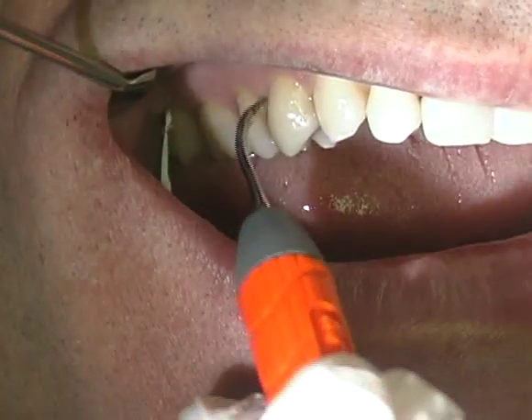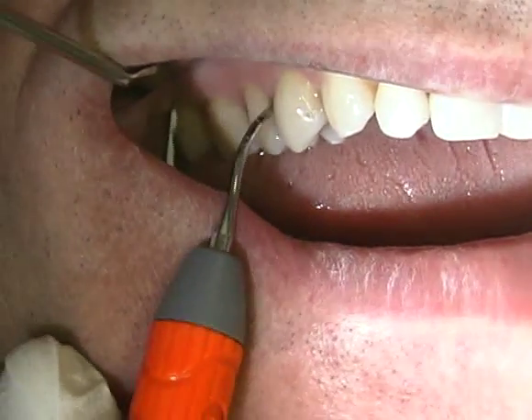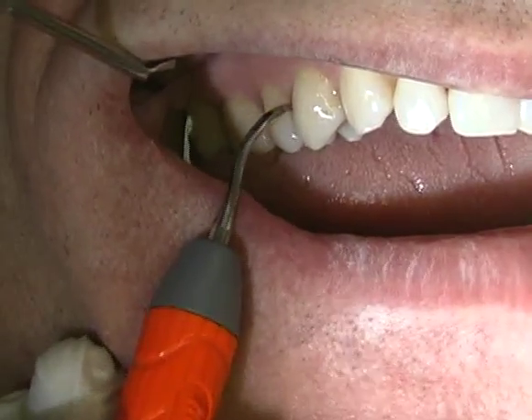Triple bend inserts can be used on all accessible tooth surfaces and are most effective on buccal and lingual surfaces of all teeth and interproximal surfaces of anterior teeth.